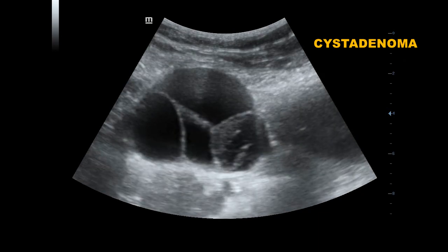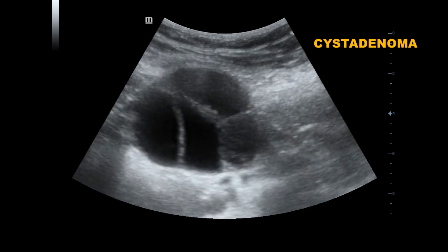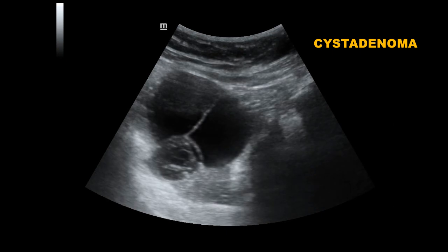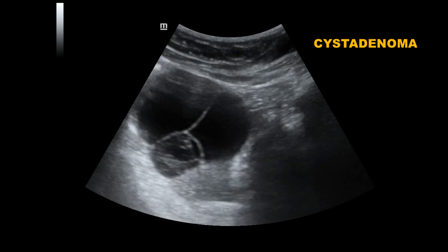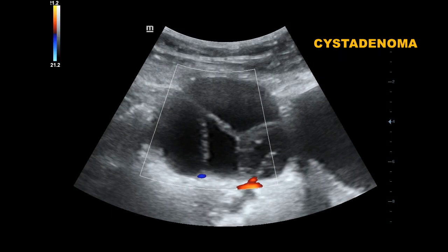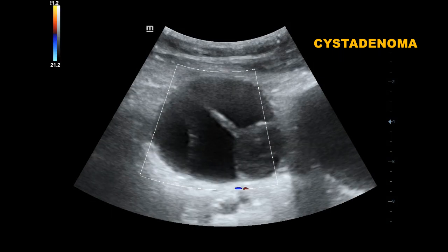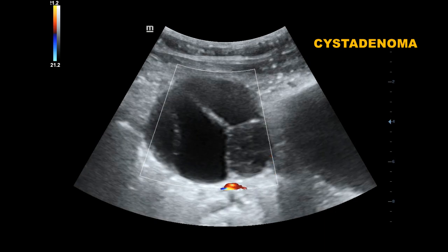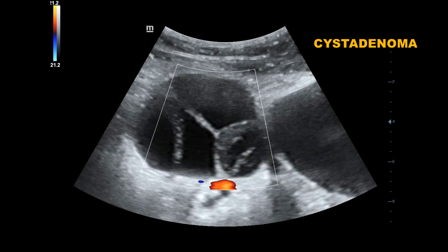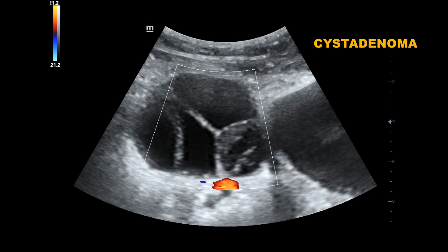This is a multilocular cystic mass, with the possibility of a cystadenoma containing multiple thin septations. There are no papillary projections or solid material within the cyst.